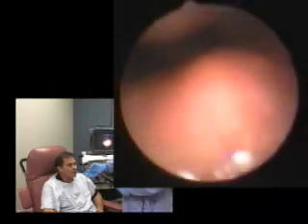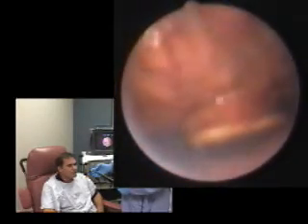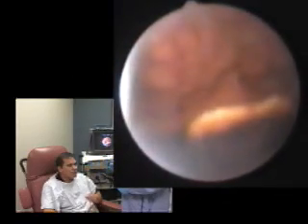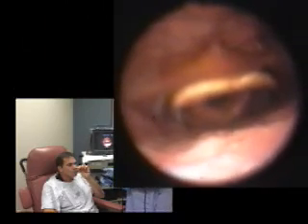And we are going to advance down the, yes, he swallowed. Pretty good. Advancing down to the pharynx. Because we have not used any numbing material, the pharynx obviously is very sensitive. Chuck, could you reach up and grab the scope next to your nose? Just hold it there, don't let it in or out, so I can adjust the view a bit. That was a good swallow. Okay, now we are much more clear.